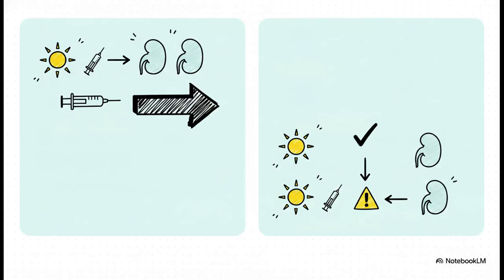Now, your clinic's workflow is going to dictate how we stage the test. You can opt for a sequential one-day protocol. That's where you do a baseline scan with a low dose of tracer, immediately followed by the post-Captopril scan with a much higher dose. Alternatively, there is the highly efficient 2-day conditional protocol.